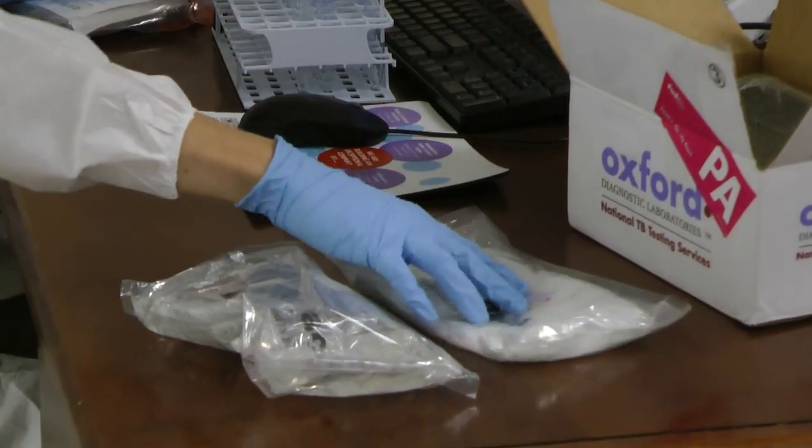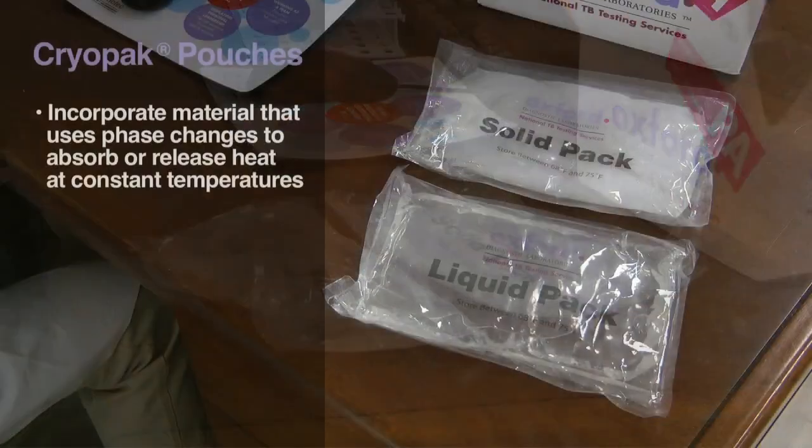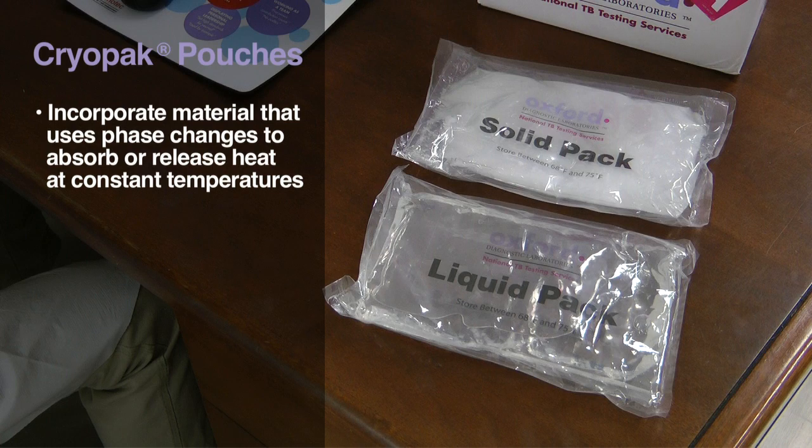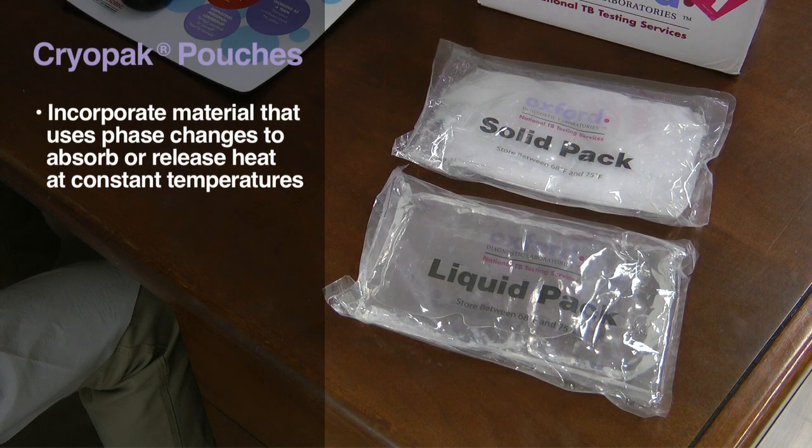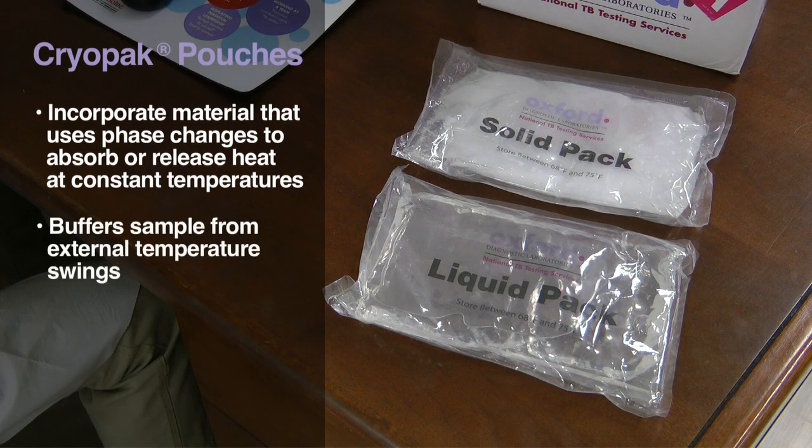The shipping container makes use of cryopack pouches. These pouches incorporate material that uses phase changes, for example melting or freezing, to absorb or release heat at constant temperatures and thereby buffer the sample from external temperature swings during shipping.